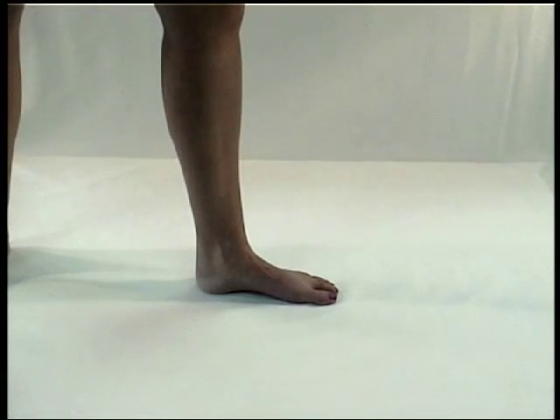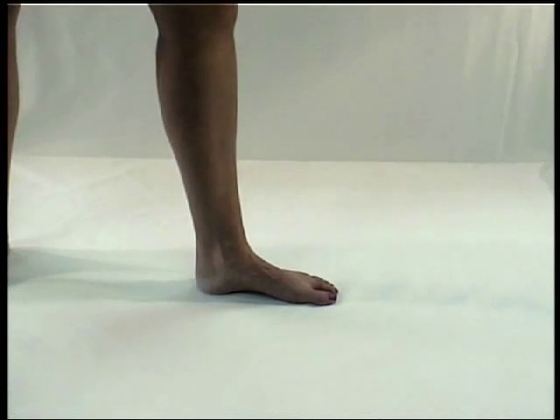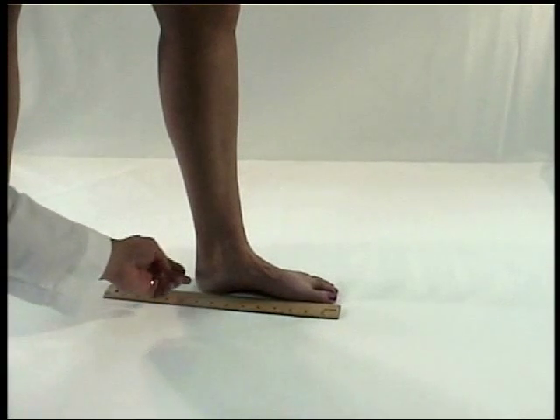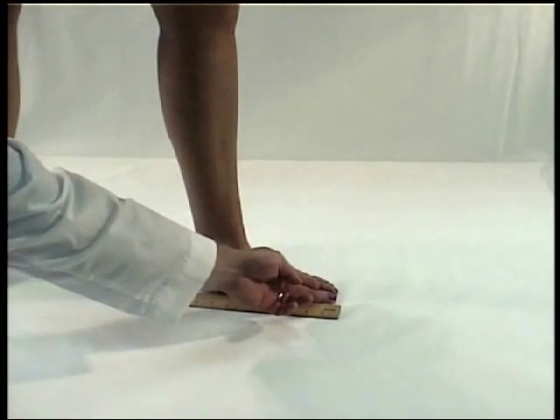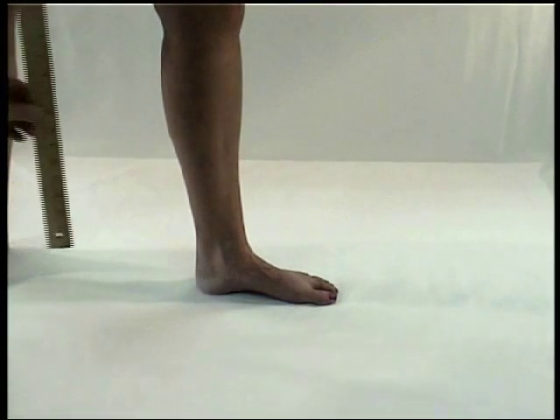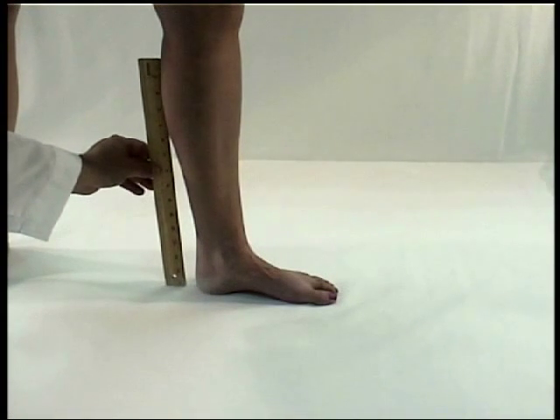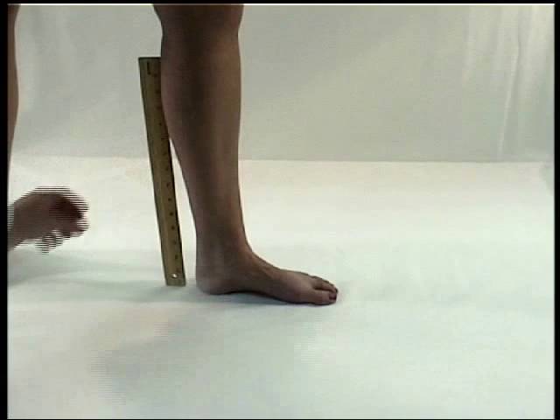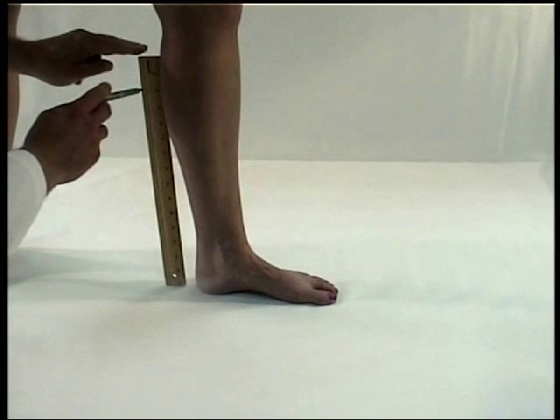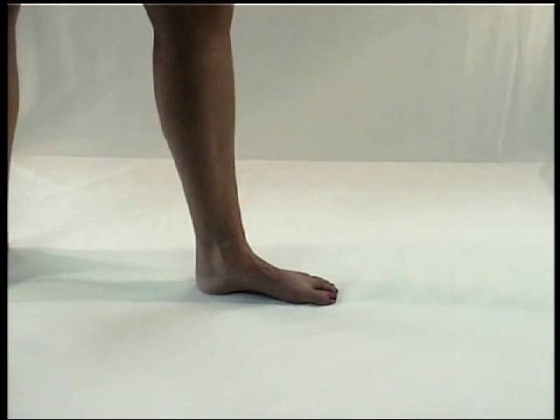These measurements should be determined with the patient standing, if possible, or in the supine position. First, measure the distance from the posterior aspect of the heel to the most distal point of the large toe for the adjustable toe extension segment. Proceed to take a measurement from the base of the heel to the apex of the calf muscle for the adjustable calf extension segment. You may also place a small mark on the patient's calf to ensure the height of the calf segment is properly placed.